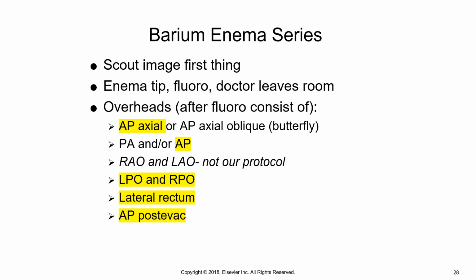Okay, it'll be stopped and started multiple times during the exam, and every time they say barium on, we repeat it. If they say barium off, we repeat it, and we do whatever it is. We either open the clamp or close the clamp.